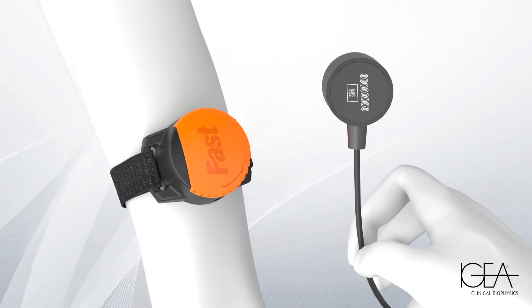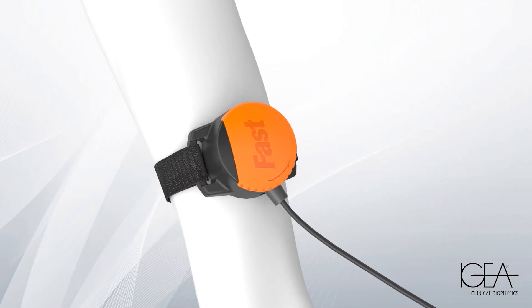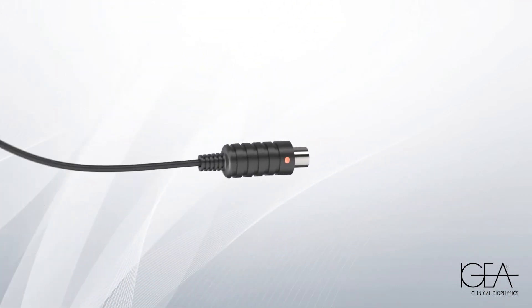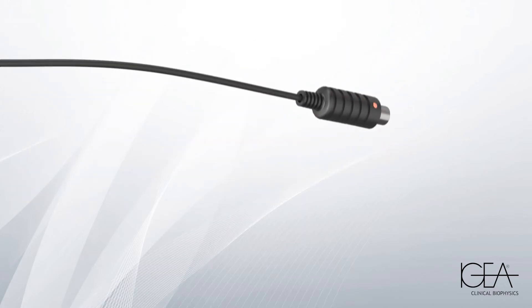Insert the transducer into the holder, placing the side with the gel facing down. Close the lid of the transducer holder by turning it sideways. With the symbol facing up, connect the transducer to the generator.